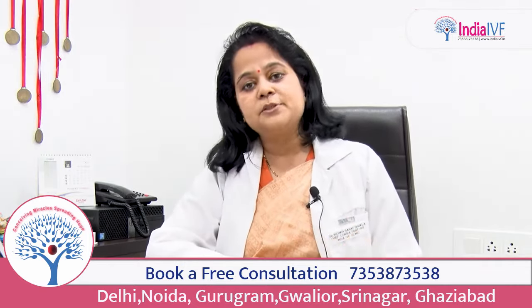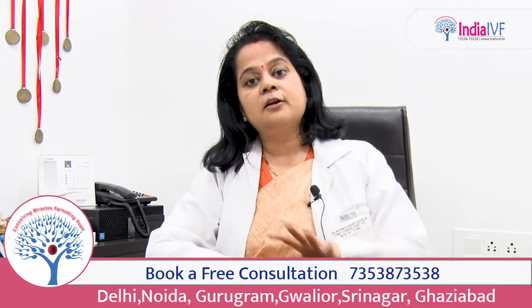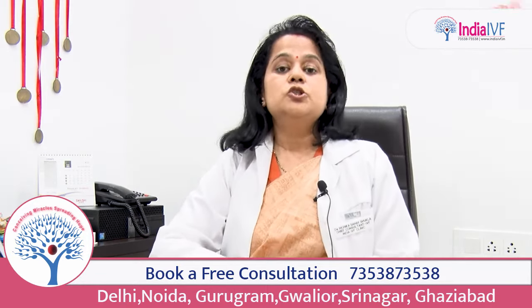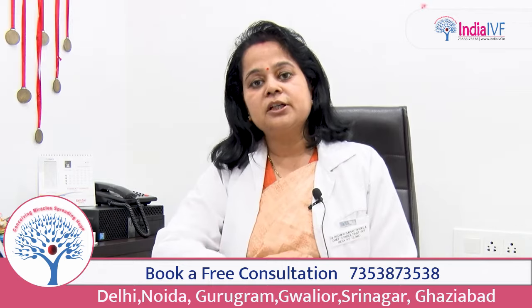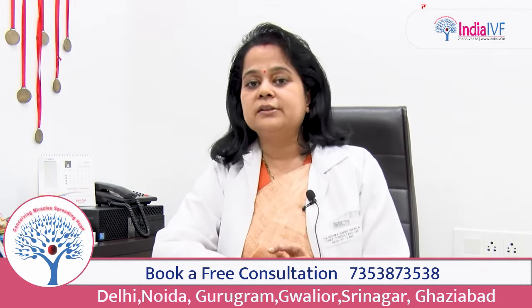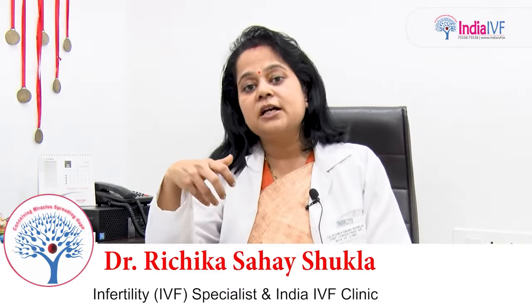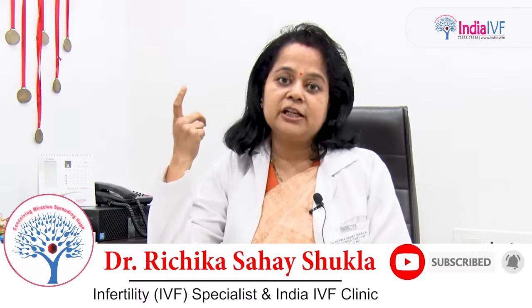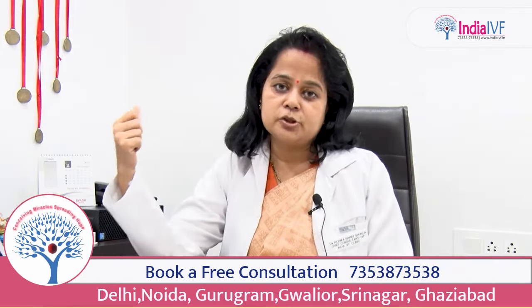It's not only the biopsy or the TB test that is done. There are different comprehensive panels that are done when the hysteroscopy is clubbed. So the hysteroscopy procedure doesn't target only one thing, but many things together, and in the crux it gives us an insight into what to do for the patient who is having these recurrent failures or pathological problems in the uterus.